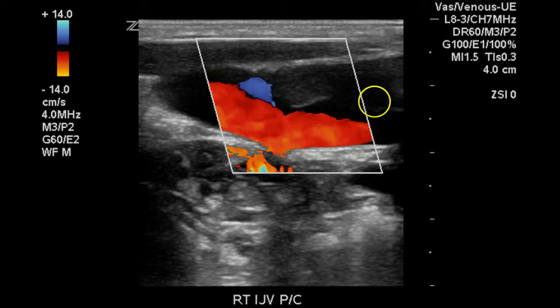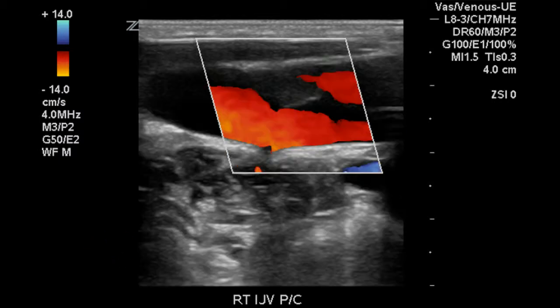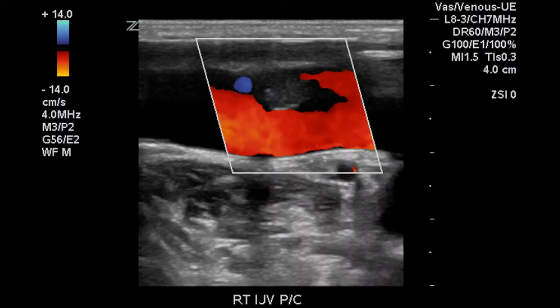This is all thrombosis as well, seen in this more central portion of the jugular vein. Another image demonstrating the irregular surface of the thrombus, and one more demonstrating the same.